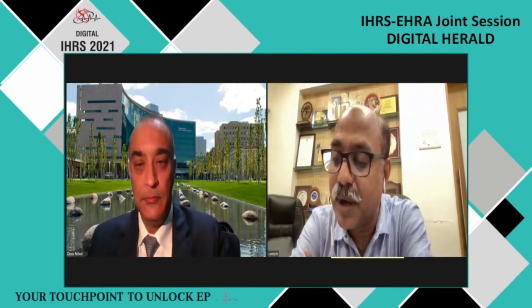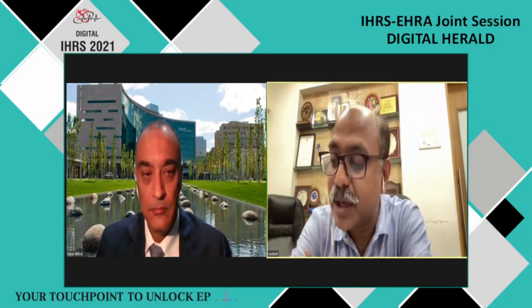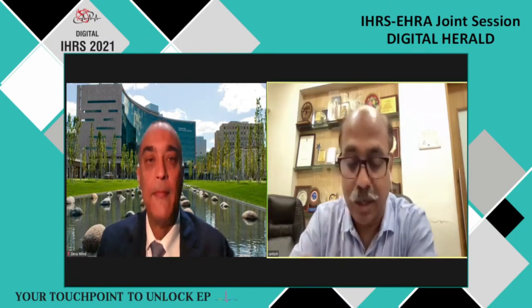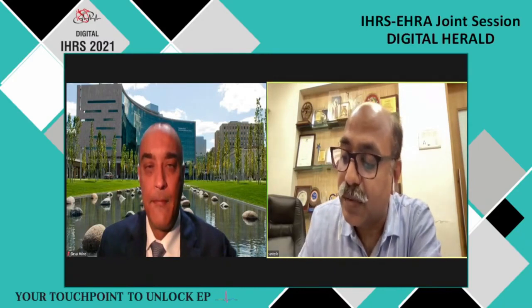Dr. Bhavin Jankaria told us about arrhythmogenic right ventricular dysplasia, and also to some extent about arrhythmogenic left ventricular dysplasia. Dr. Johann Christopher talked about amyloidosis and sarcoidosis and the role of CMR in identifying them.